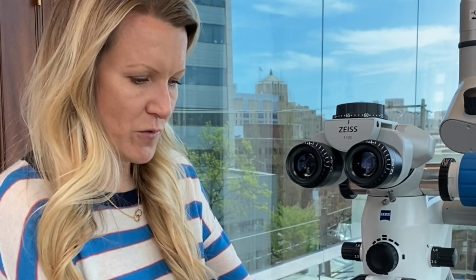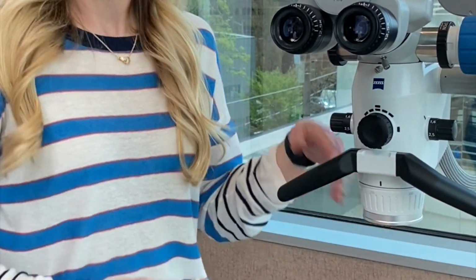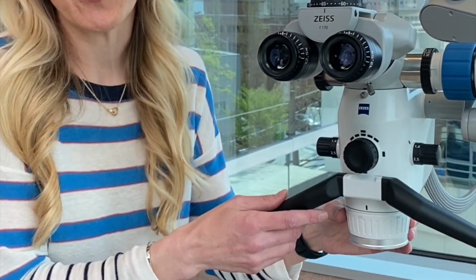And this is basically your working distance from the operating field. Somebody who is shorter is going to have a shorter torso, shorter working length, and they're going to have this number a lot lower. Whereas somebody with a longer torso, like my husband, is going to want to sit a little bit farther away from the patient and from the operating field, and so he may have that dialed up to a 300 even potentially. I do notice that personally when I am working in a patient's mouth, my working distance is often shorter, whereas if I am outside of the patient's mouth, I may bring my hands a little bit farther away from the lens and dial this out a little bit just to give me a little more space with dust and drilling, like maybe trimming a temporary, that sort of thing.